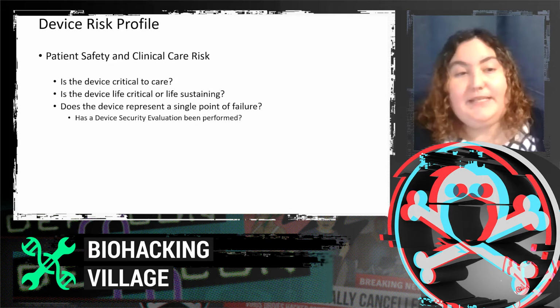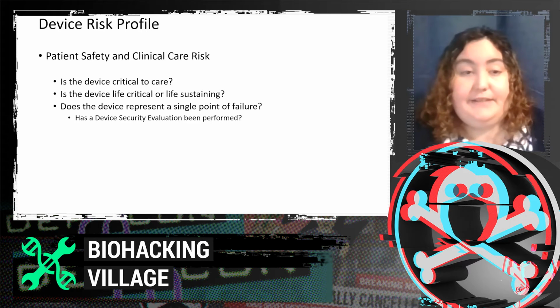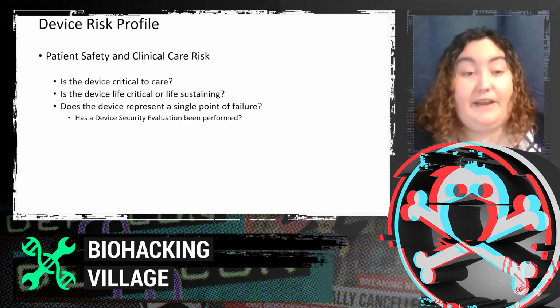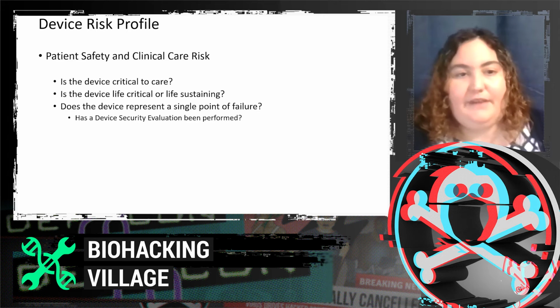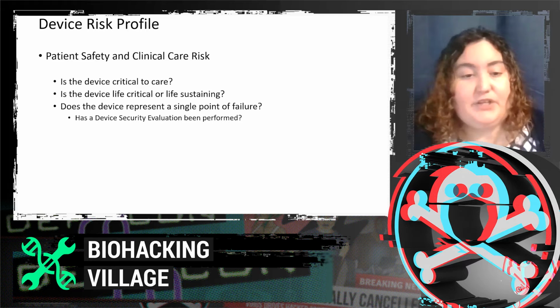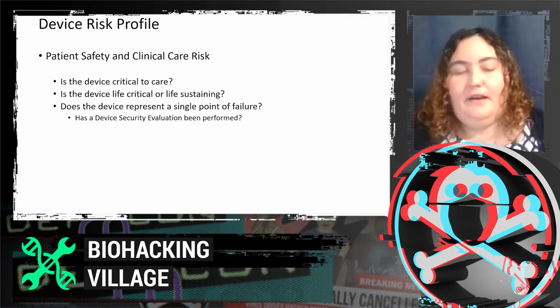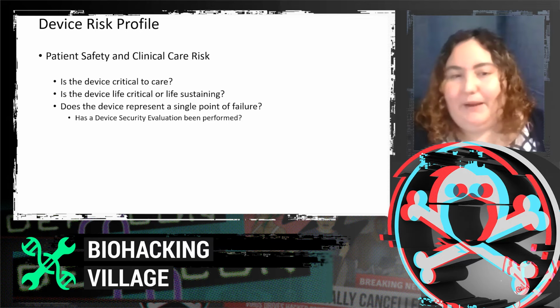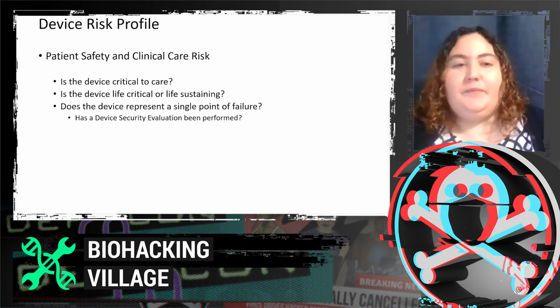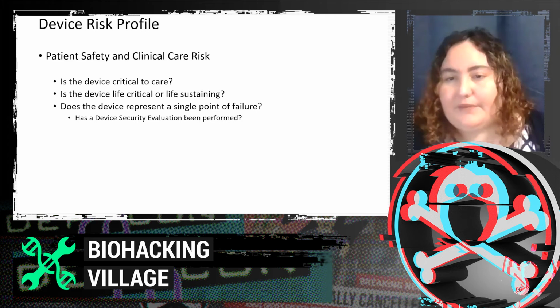You are also going to need to figure out how critical this device is to care. Is it life-sustaining? Does this represent a single point of failure? Has a security evaluation been performed? You're allowed to ask your medical device manufacturer, hey, what security testing has been performed on this device? What did you do about it? Especially if this is critical to care, you might want to have those conversations.